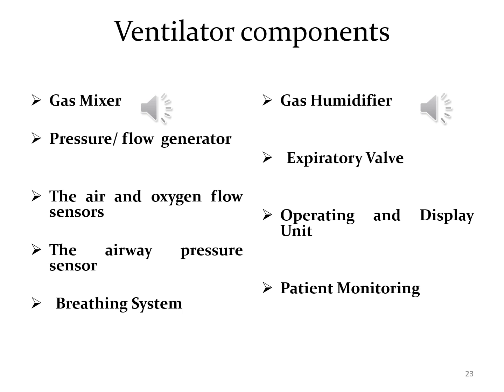Patient monitoring: to monitor the patient's vital functions. This includes, for example, electrocardiogram or EKG, blood pressure, non-invasive or invasive, oxygen saturation, and often also the measurement of the carbon dioxide concentration in the breathing gas.